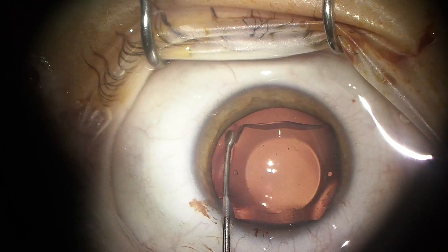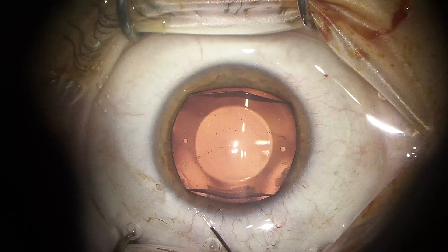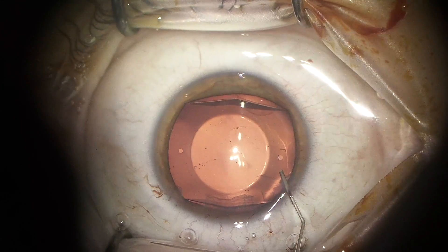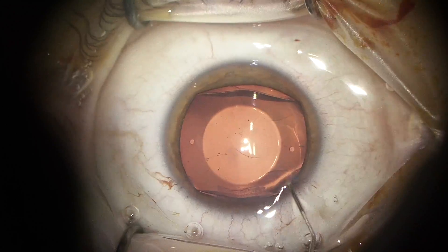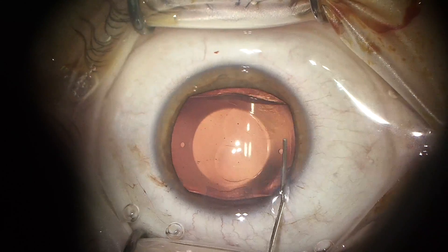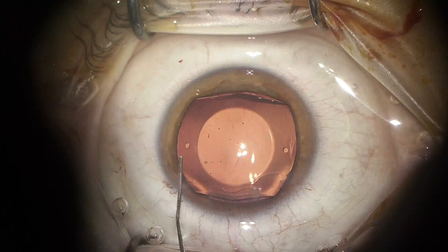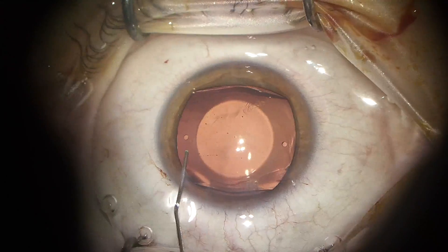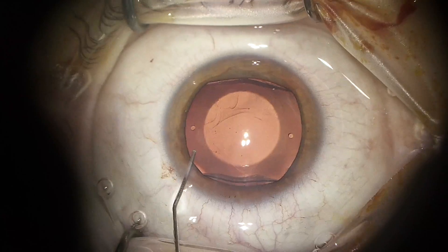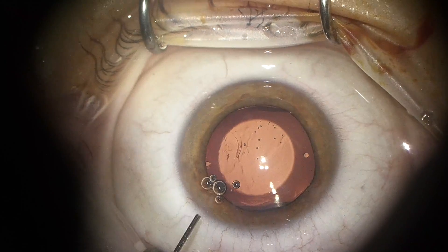I take care not to disturb the iris or the natural lens which is right behind the iris, as doing so would result in a cataract. Once the lens is situated perfectly behind the iris, I'll take this irrigating solution. The whole purpose — as you can see the fluid waves within the anterior chamber — is to push all the jelly out of the main incision, so the eye will be filled with the proper solution and not the jelly-like substance. If the jelly stays within the eye, it can cause glaucoma.